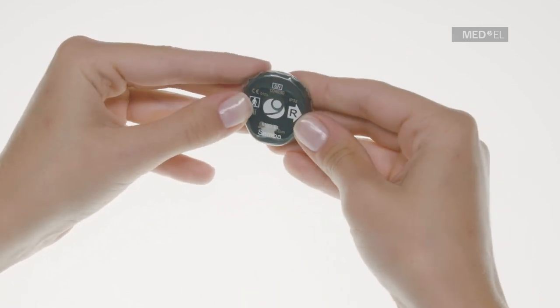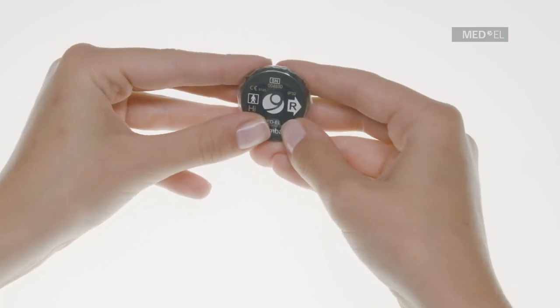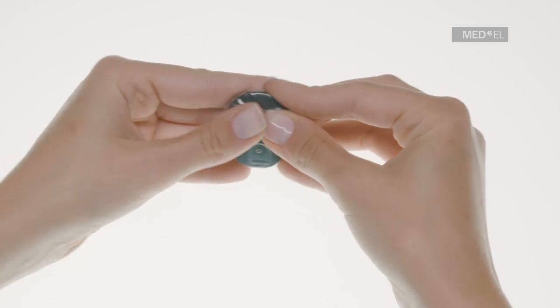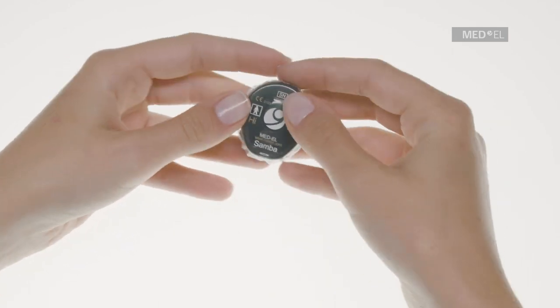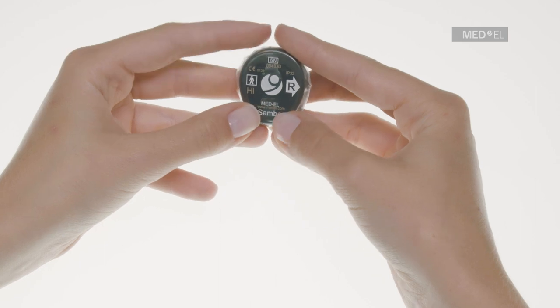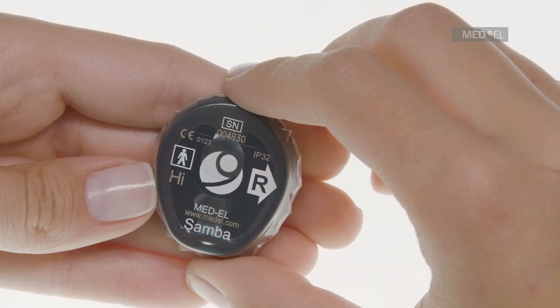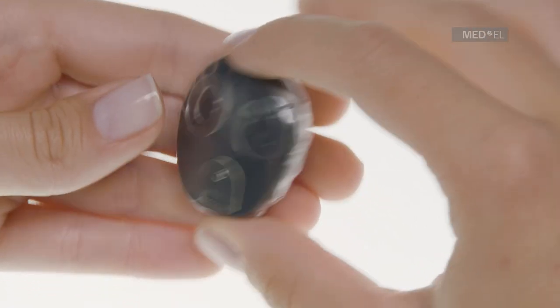Pull Waterwear over the entire processor. It will form a tight fit, so some tension with Waterwear should be expected. The overlap should be evenly distributed around the edge. For a watertight closure, it is essential that no wrinkles form on the flaps or edges of Waterwear.